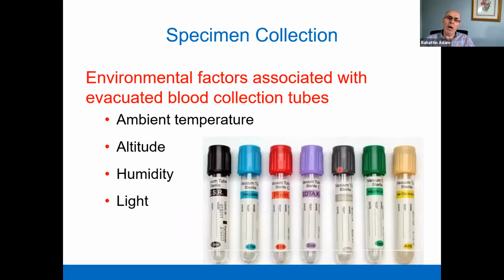Now we are collecting the blood into test tubes. These are evacuated tubes. We call them evacuated blood collection tubes.